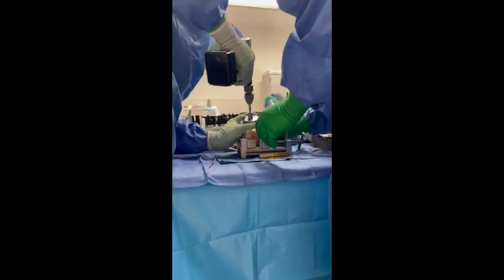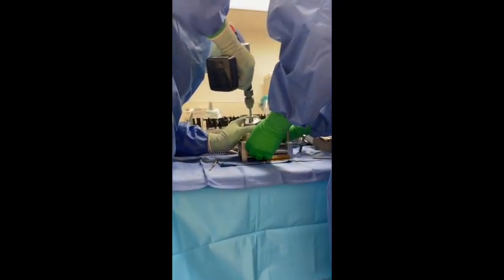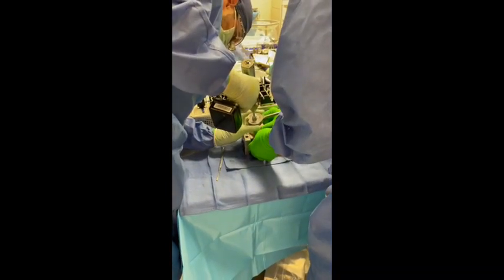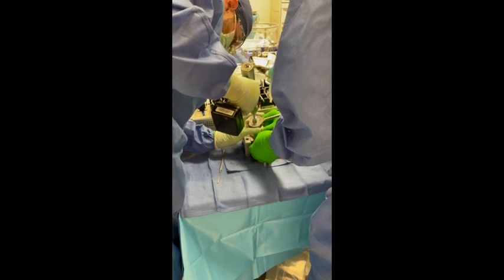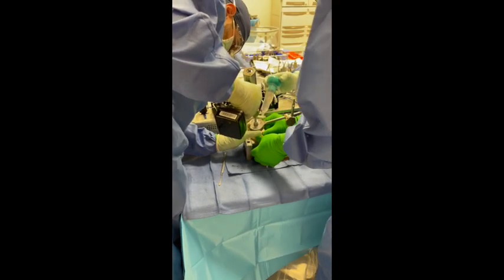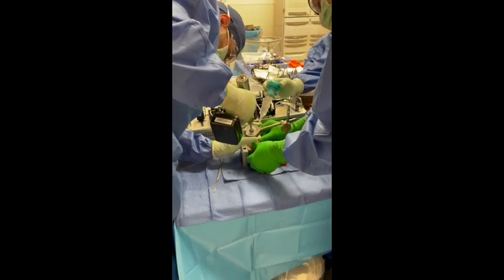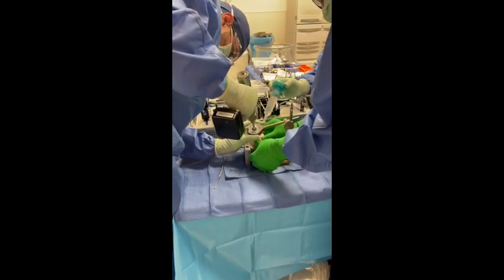After choosing our position, the external guide was utilized to set, and a 15 millimeter reamer was utilized to harvest a plug of approximately 12 depth, being careful to preserve the excess cartilage in case we were unhappy with the graft and wanted to try reharvesting a secondary plug.